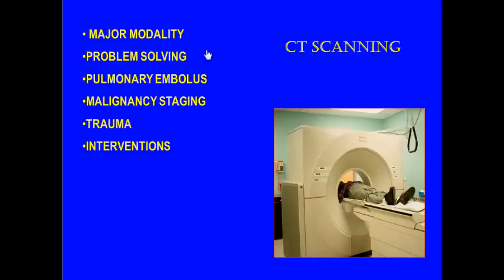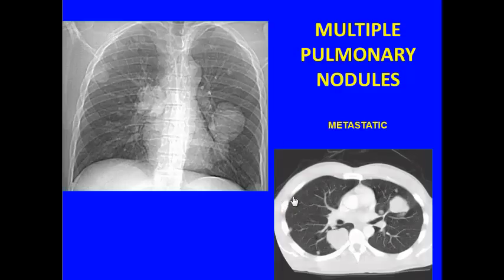It's a really major modality for problem solving, great for evaluation for pulmonary embolus and malignancy staging, and really is a go-to imaging study for trauma, also directs some of the interventions. So what can we tell? Well, from this x-ray we can see all these rounded areas overlying the lungs here.